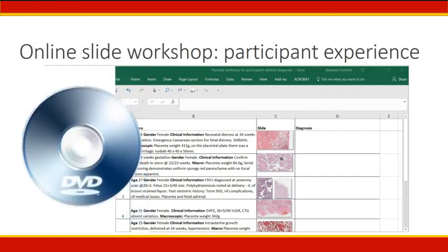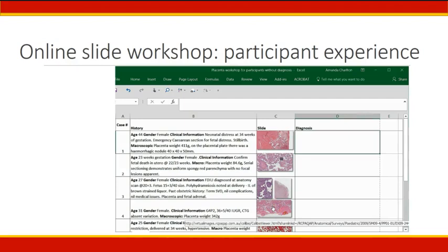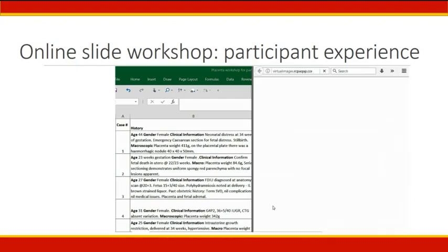So who has made workshops for teaching registrars? Quite a few. I've used glass slides or scanned slides on DVD in the past, but now I will show you how I created a workshop using online virtual e-cases and an Excel spreadsheet. It's free, fast, and easier to assemble, and there is a permanent resource for the learners.